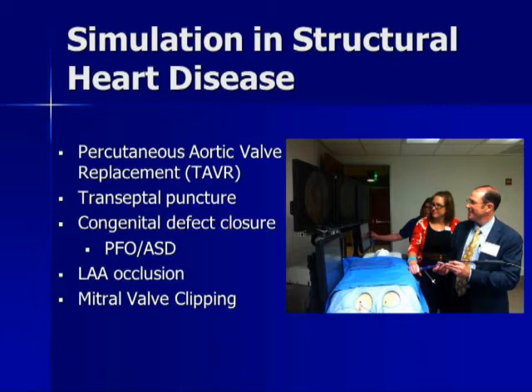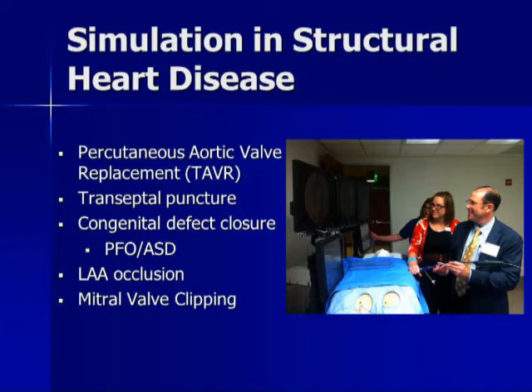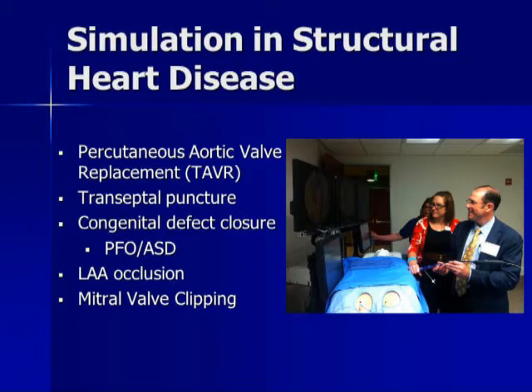And it was interesting on Rebecca's slide, the 2 things that are the most interesting for simulation happen to be percutaneous aortic valve replacement and valvuloplasty, which is a requirement for percutaneous aortic valve replacement. This is a revolutionary technology in that we're able to now put in, fully through the femoral artery, a full working aortic valve. Right now it's FDA approved for those that are deemed not surgical candidates under CMS.